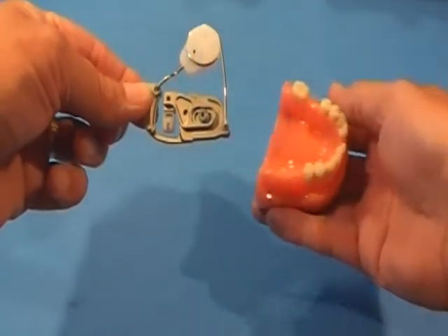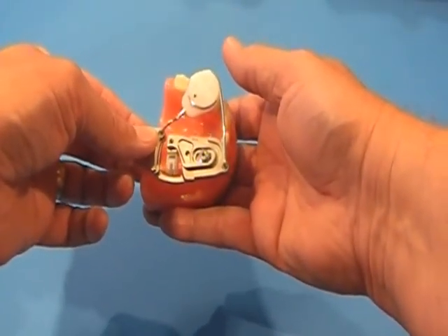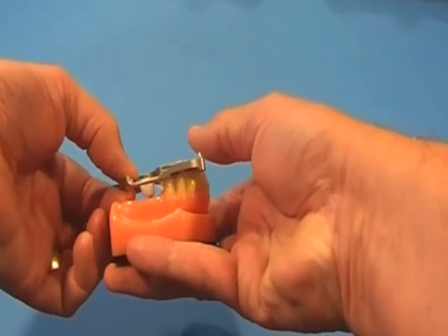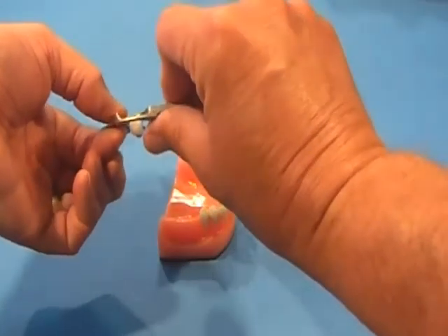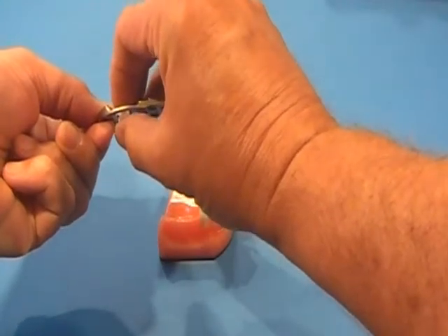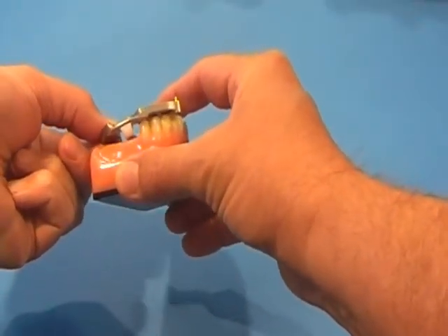The guide itself also has four unique features. First, it is one size fits all. With this cross arch platform, it easily adapts to any arch form. And if needed, you can easily bend the guide to conform to any unusual occlusal plane.